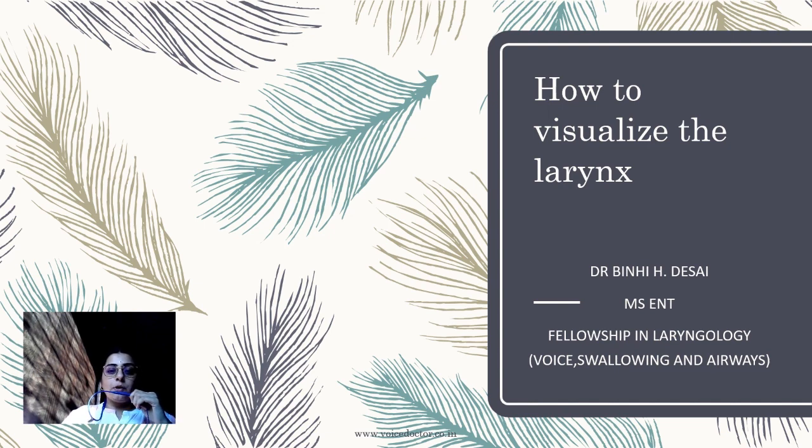Today I'll be talking about how to visualize the larynx. The larynx is also called the voice box. The functions of the voice box are mainly three: speaking, breathing, and swallowing. So, if any patient comes with any of these complaints and we think the patient has a problem at the level of the voice box, we need to know how to visualize it, and we need certain tools to visualize it.